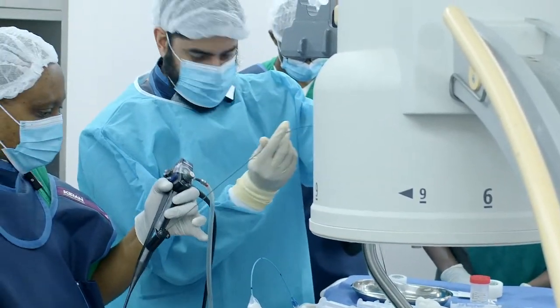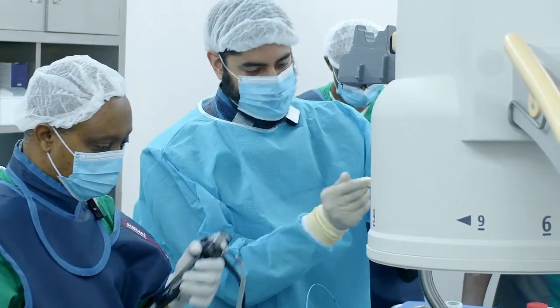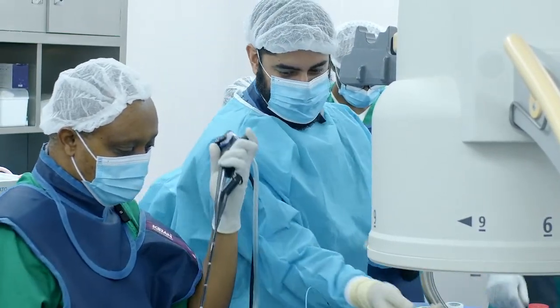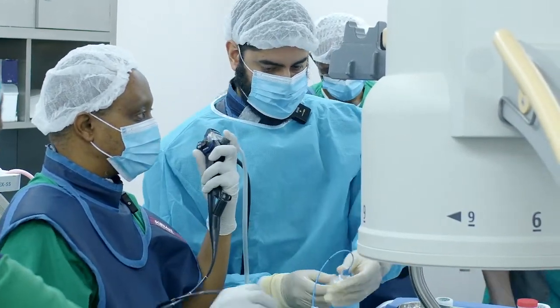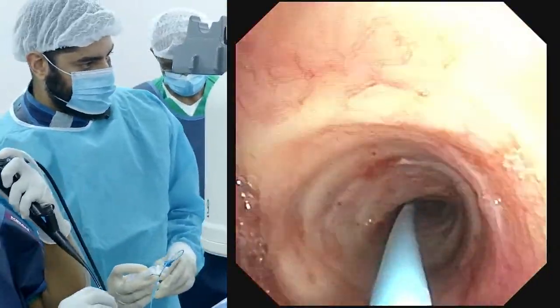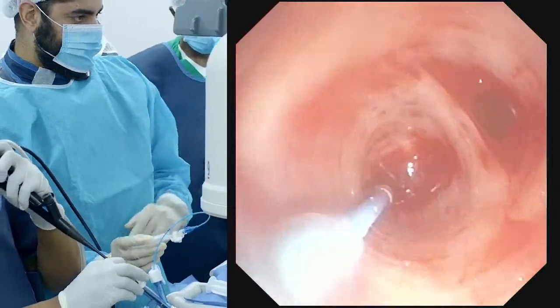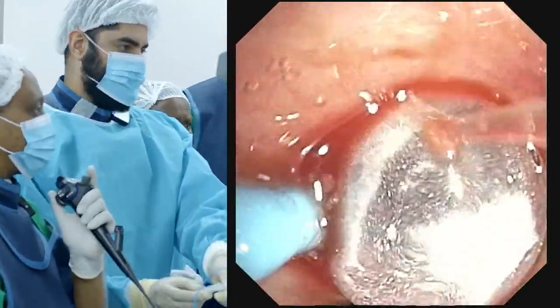No, it's okay. It's not bad. No, I think we're good now. Yeah. We've got about 5 pieces now. Yep. So you can look now, see with the balloon. It's blocked off whatever was going to bleed.